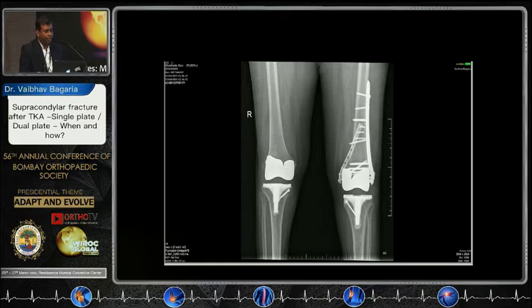This is the right and the left side. We put a plate on the medial side, simple semitubular plate, but the ideal plate is either a Philos or something that is used in buttress mode. But even a simple plate that neutralizes the shear, like a semi-tubular plate, is easy to execute, is good enough for this.